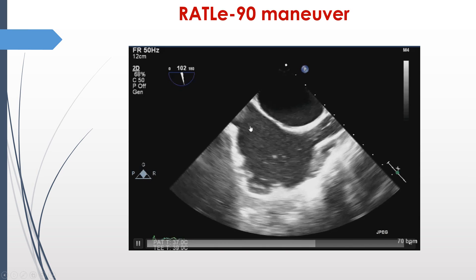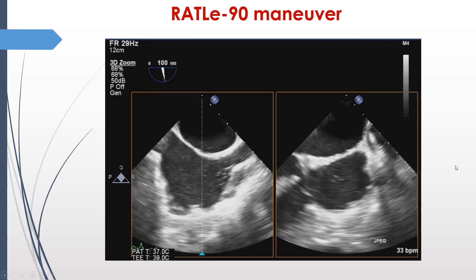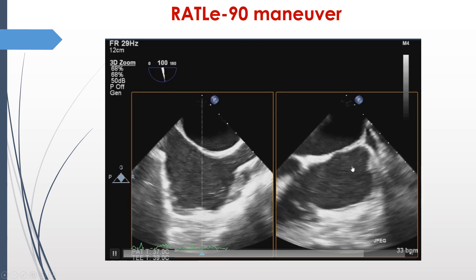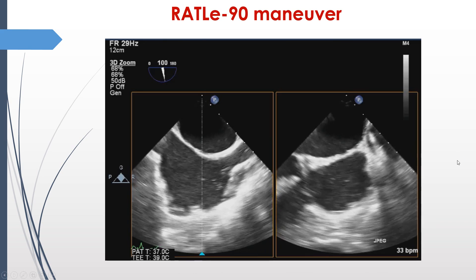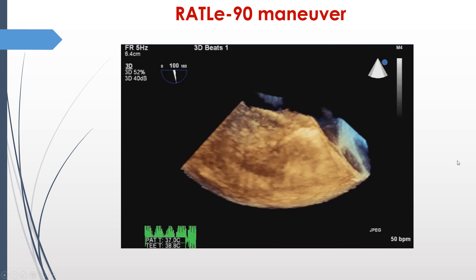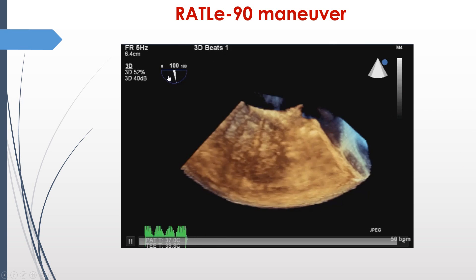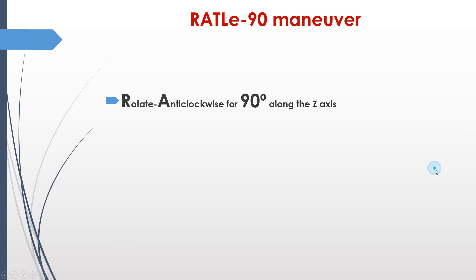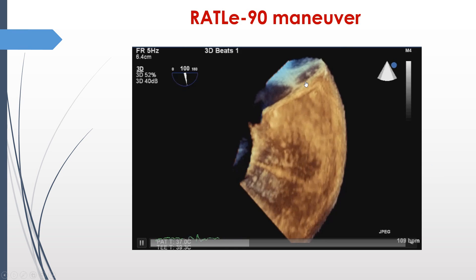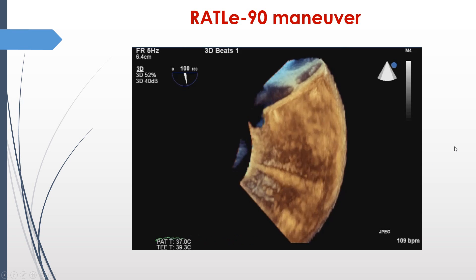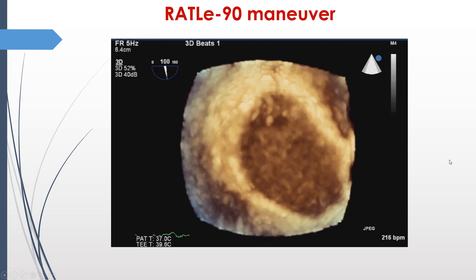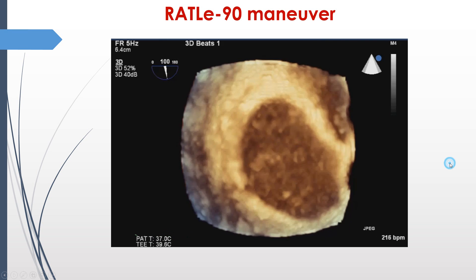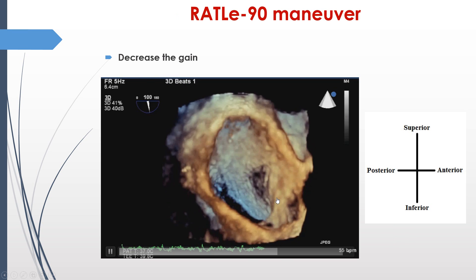We will see that in motion now, starting from the bicaval view. Once you activate the 3D zoom, the screen will be divided. Optimize your boxes to the ostia of the vena cava, include the whole septum in depth, and then acquire again. This is one-beat acquisition — that means this is live mode. The superior vena cava opening will be to the right as the reference image, then rotate anti-clockwise to bring the superior vena cava opening superiorly, and then tilt-left for 90 degrees. You will face the interatrial septum, but this brown color is the blood only.